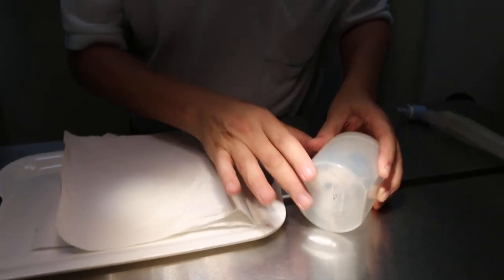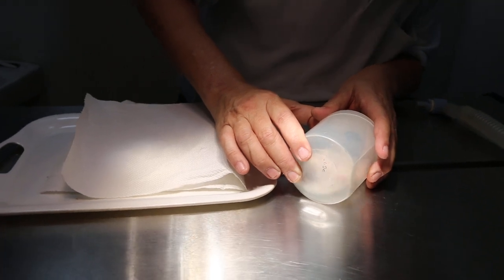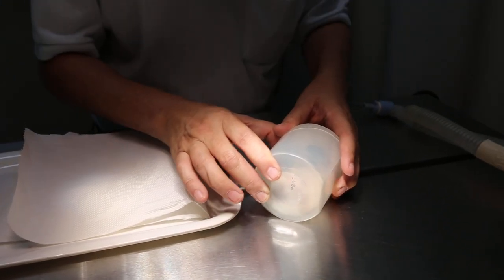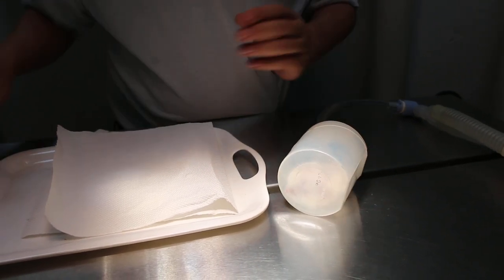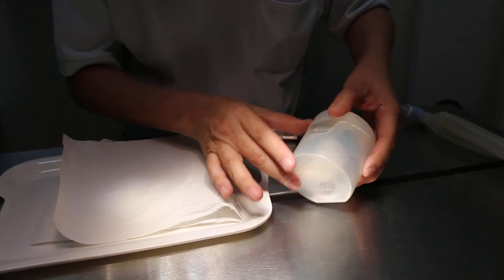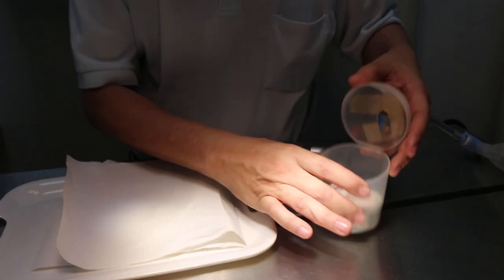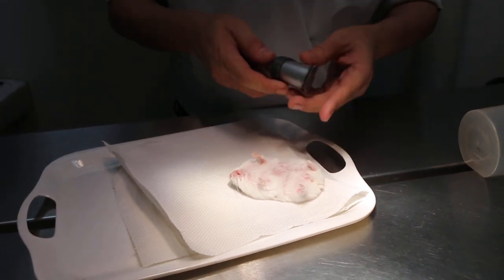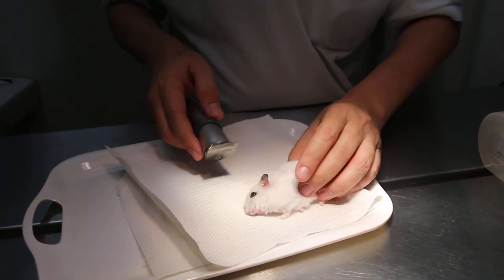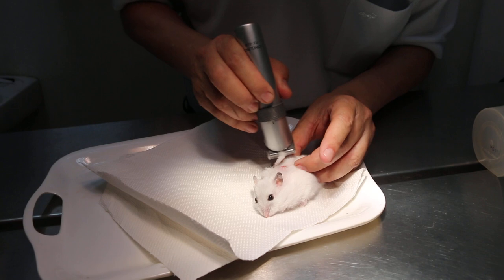It is a half open circuit. Normally it is quite fast at 5%. Make sure there is oxygen and isoflurane — if not then of course it doesn't work. You can see it has been down already, and I have the clipper ready. Okay, so pointing down here — you can see it is down — and quickly shave.